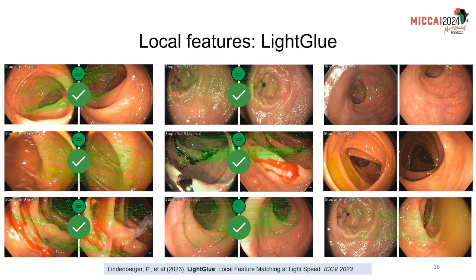But unfortunately, for some images that suffer a lot of viewpoint changes or deformation, the system is not able to match a lot of points while they are from the same place. And unfortunately, the network also gives some false positives, meaning that two images from different places are predicted as being from the same colon location, while they are not.